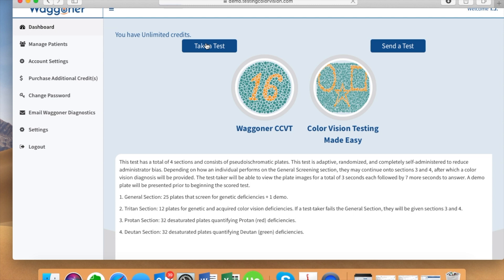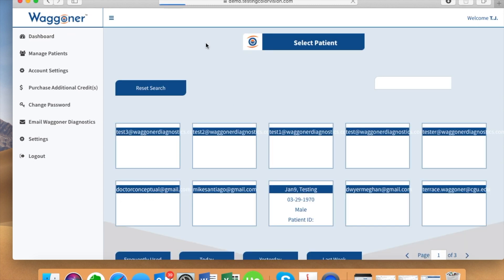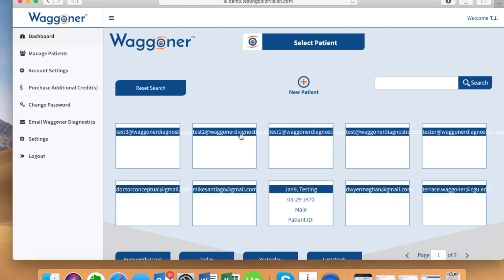You can find information about each test by selecting the test from the list. Please select 'Take a Test' to begin the testing process. This page is where you would either select your patient if they have already been entered before, or select 'New Patient' to begin adding a new test taker.